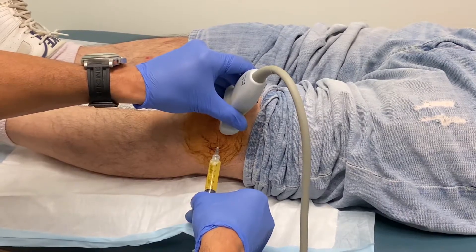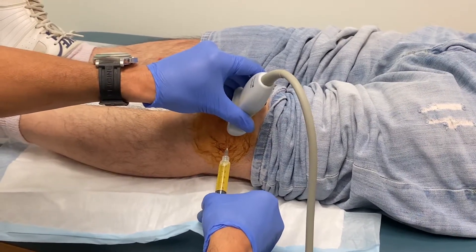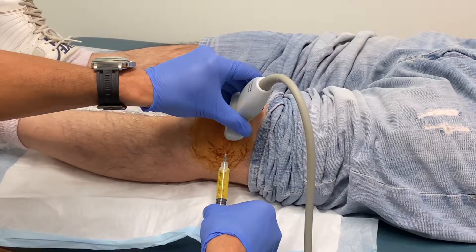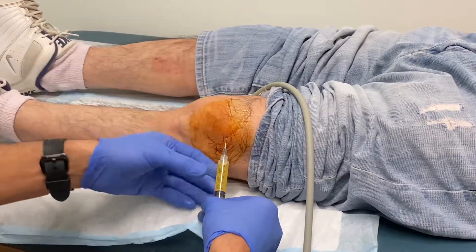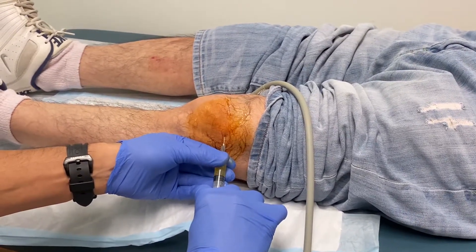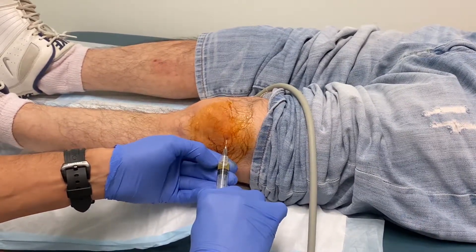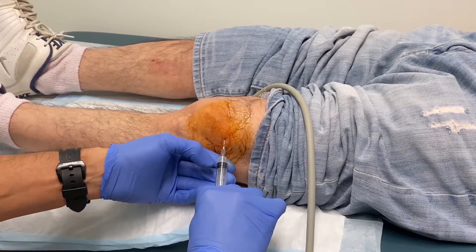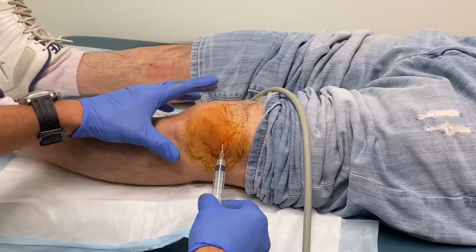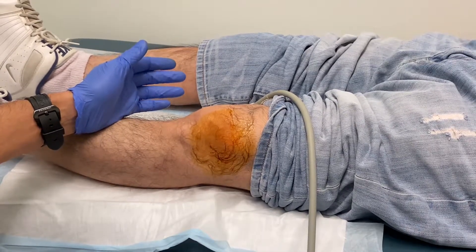There it is — I'm going to back it up a teeny bit. Did you notice that it's pretty close to the synovium? So what I do is change my angle — there we go. Now I know that I'm not going to inject into the synovium, and I just go like that. Sometimes it actually hurts once the platelets go in — sometimes they get activated and release their granules, and there's a surge. A sense of heat is what a lot of patients will feel, but in this case that hasn't happened — but it might.